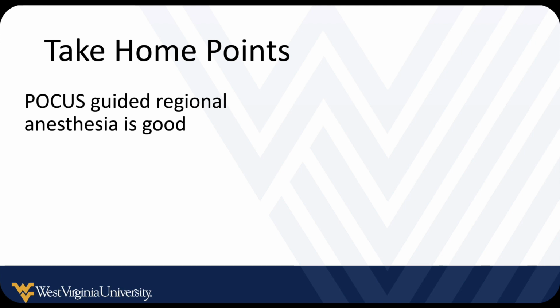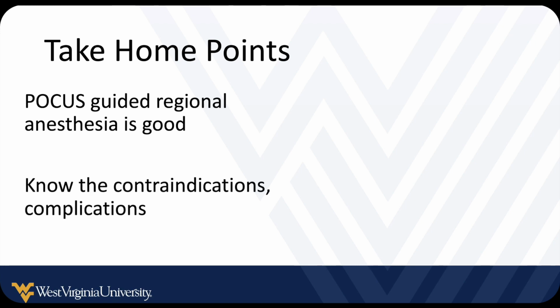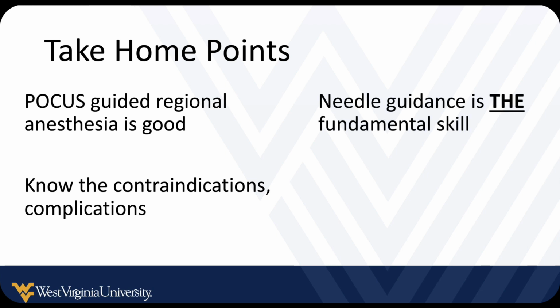So that's a good reason to incorporate this as part of your practice and as a multimodal approach to analgesia and pain management. You certainly need to know the contraindications, the complications. You need to know when patients should be monitored, what to be monitoring for, those kinds of things. And then again, needle guidance is the fundamental skill. I say this with a lot of other procedures. If you can learn to guide a needle towards a target and maybe aspirate or do an injection, then you can build on that and incorporate a lot of these procedures, including regional anesthesia, into your toolkit to help you care for patients.